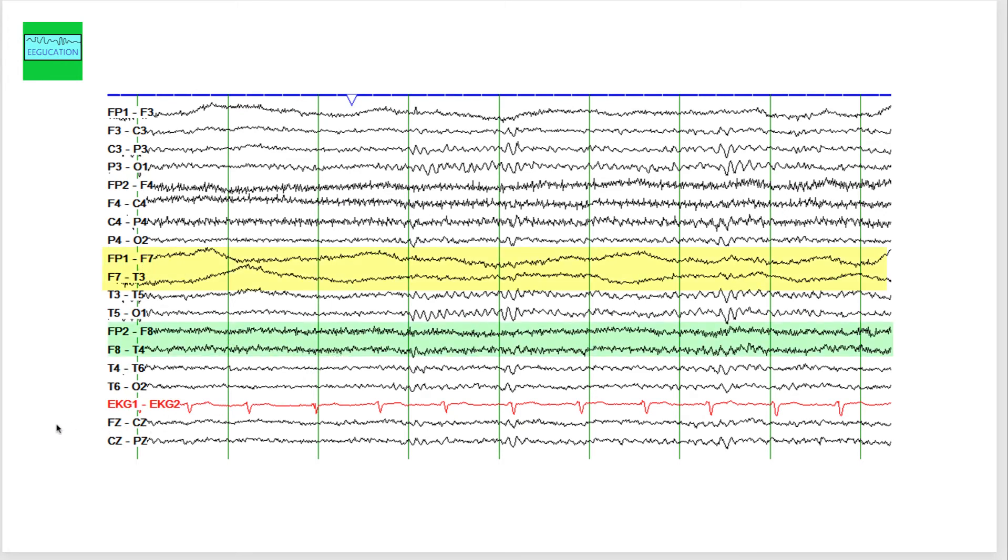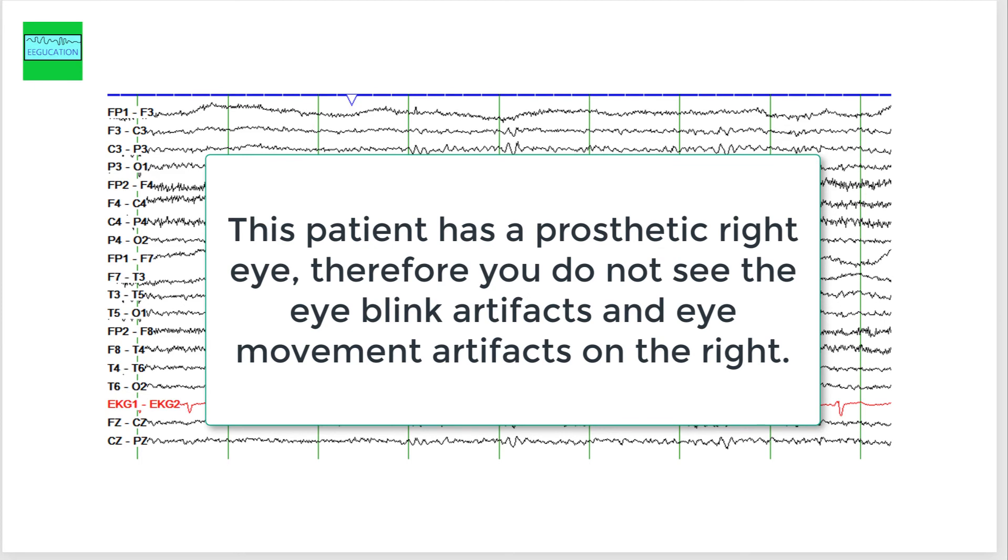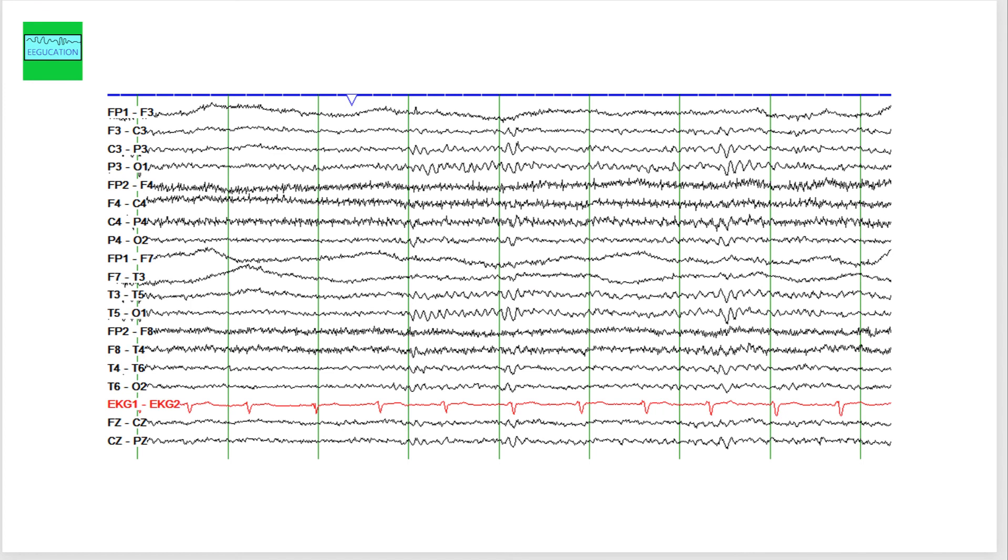The answer to the mystery here is this patient has a prosthetic right eye and does not have a right eye, the globe on the right, and that's the reason you see asymmetric eye blinking and asymmetric lateral eye movements.